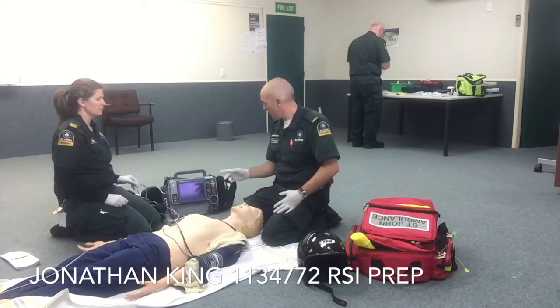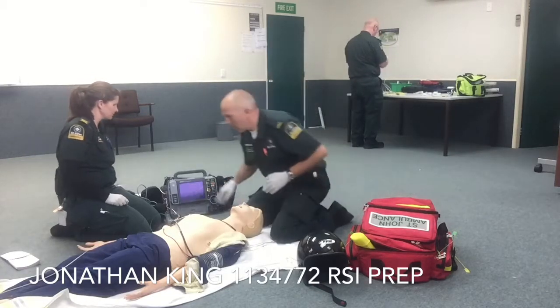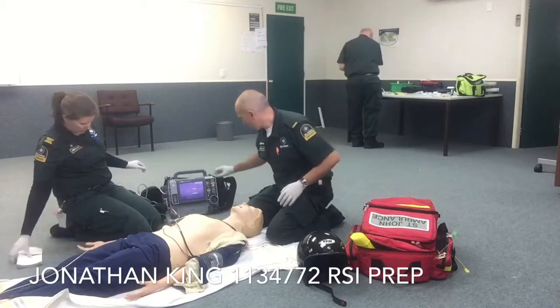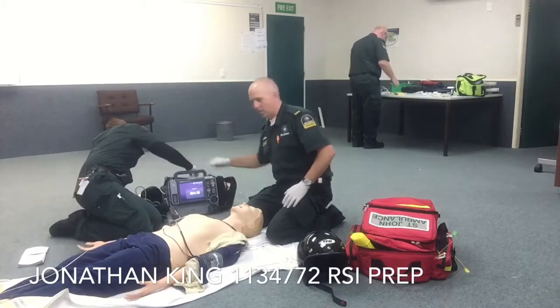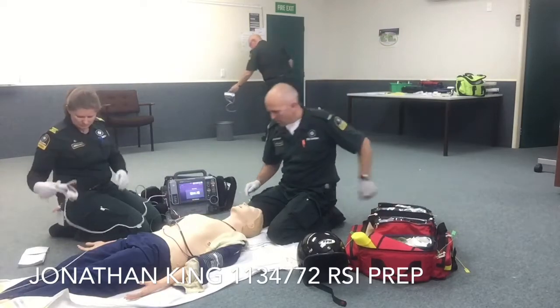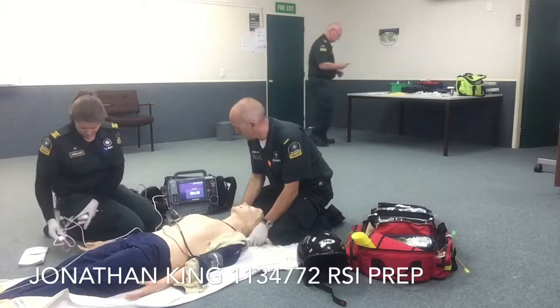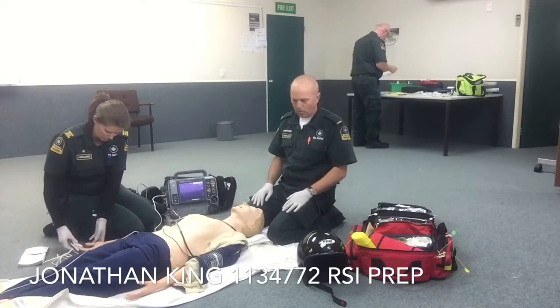Alright, so yeah, Joe, we'll pop this on. We'll give him some, if we get SpO2 on him. Just tucked around the back there. Okay, Taupo 1 to control. And we're going to call for an RSI. So they're on their way.